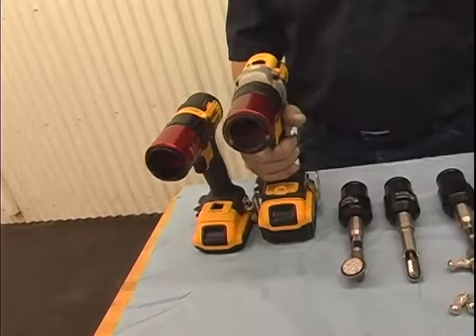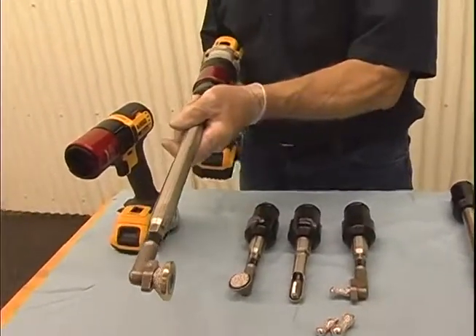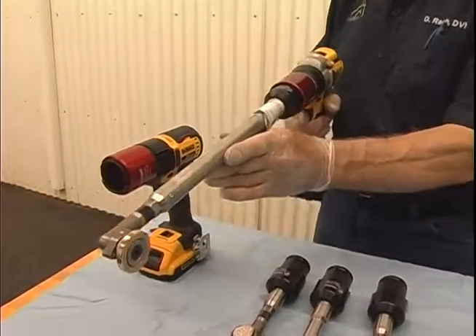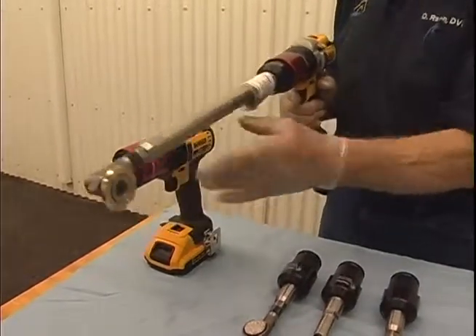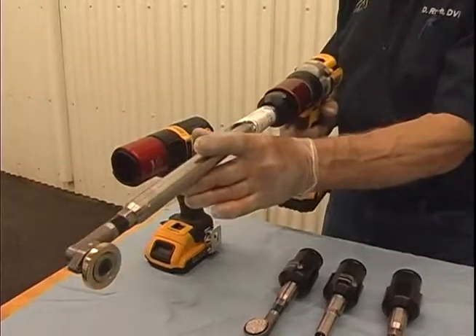stand too much weight. One advantage to this chamfer burr, though, is that when you're floating, you don't have to turn your elbow out, because when you're removing the sharp edges, the gun is being held straight up and down. So it's very easy on your arm.